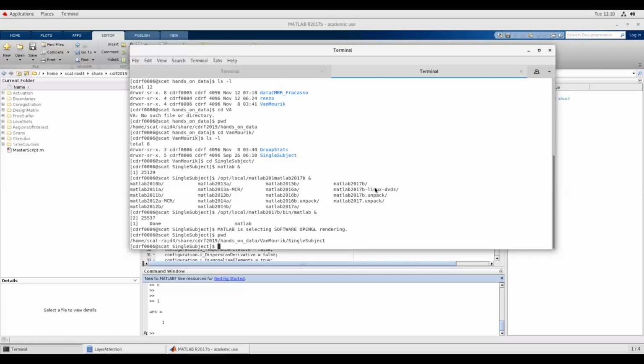What's that? I'm not good at drawing ampersands. I never have been. Do you guys do this just for ampersands? Big and. Optional. Here you can put it as an ampersand. And there's a little bit of a long tail there. Right. This is optional. Let's see. Oh yeah. I see a server there. That's brilliant.